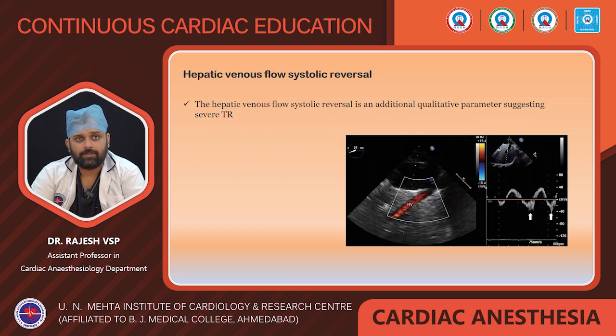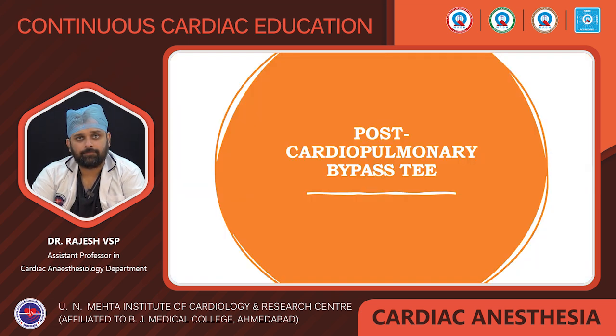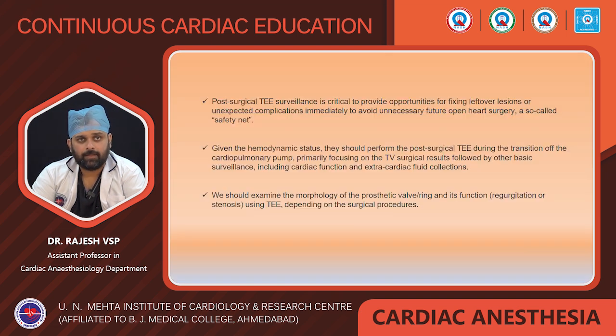Coming to the hepatic venous flow, systolic reversal is an additional qualitative parameter suggesting severe TR. Coming to post-cardiopulmonary bypass TEE, post-surgical TEE surveillance is critical to provide opportunities for fixing leftover lesions or unexpected complications immediately, to avoid unnecessary future open heart surgeries, the so-called safety net.